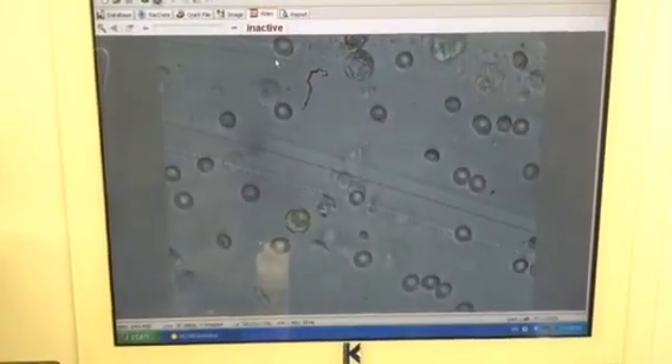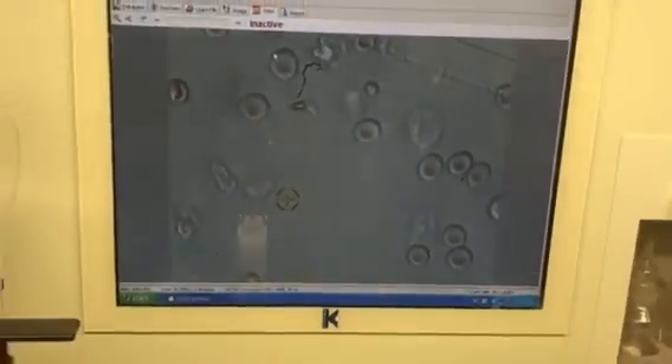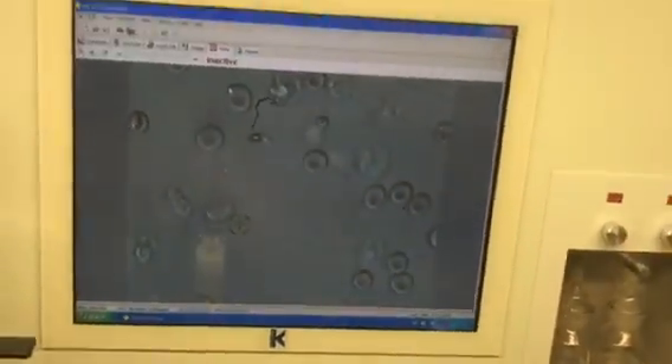First of all, you can see there is an immotile sperm also. There is an immotile sperm here.